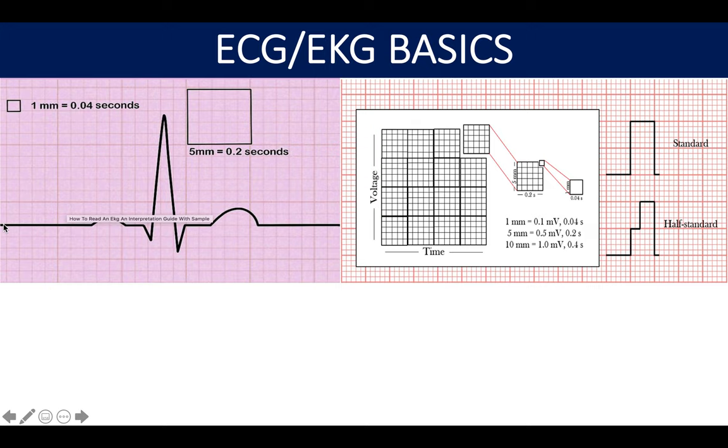One more important thing to recognize is the isoelectric line. The isoelectric line is a point of baseline where everything is at 0 millivolts and 0 seconds.